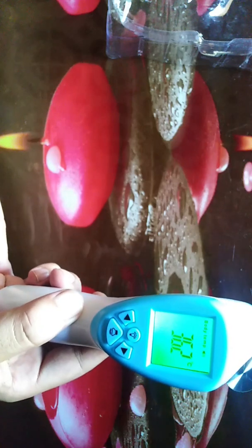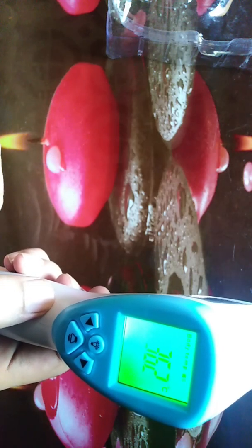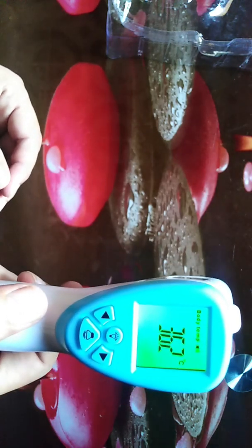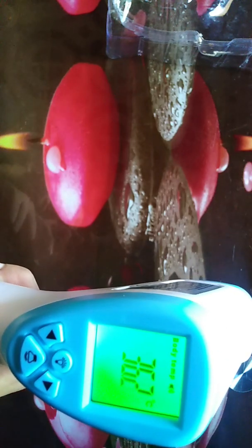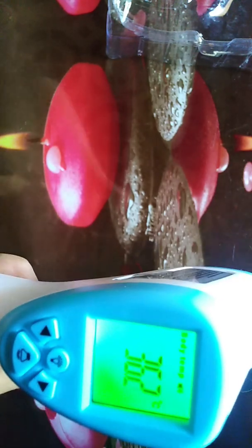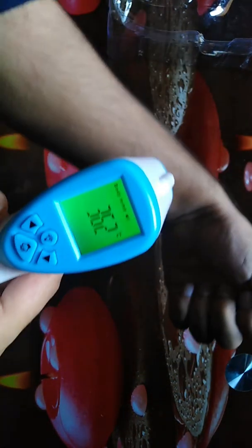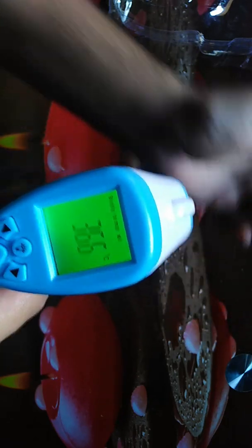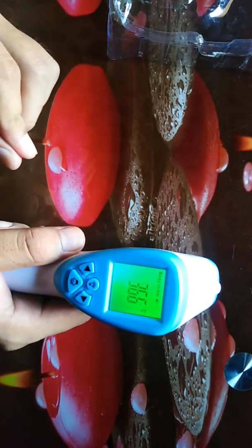When you turn it on for the first time, you can see it shows the temperature in Celsius. For the first time, you may need to convert it to Fahrenheit. By default it will show the temperature in Celsius, so you need to change the unit to Fahrenheit to measure body temperature.